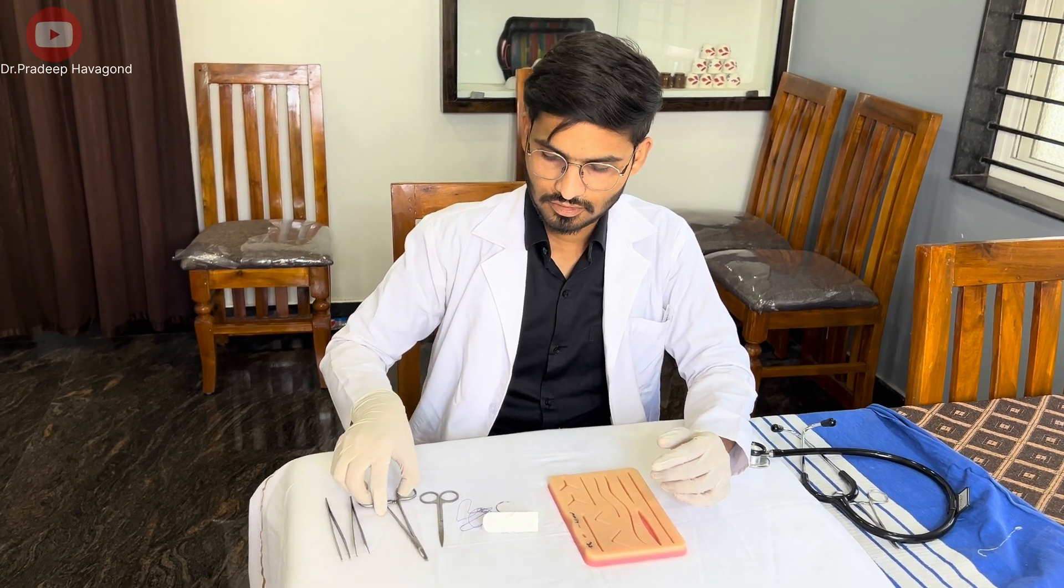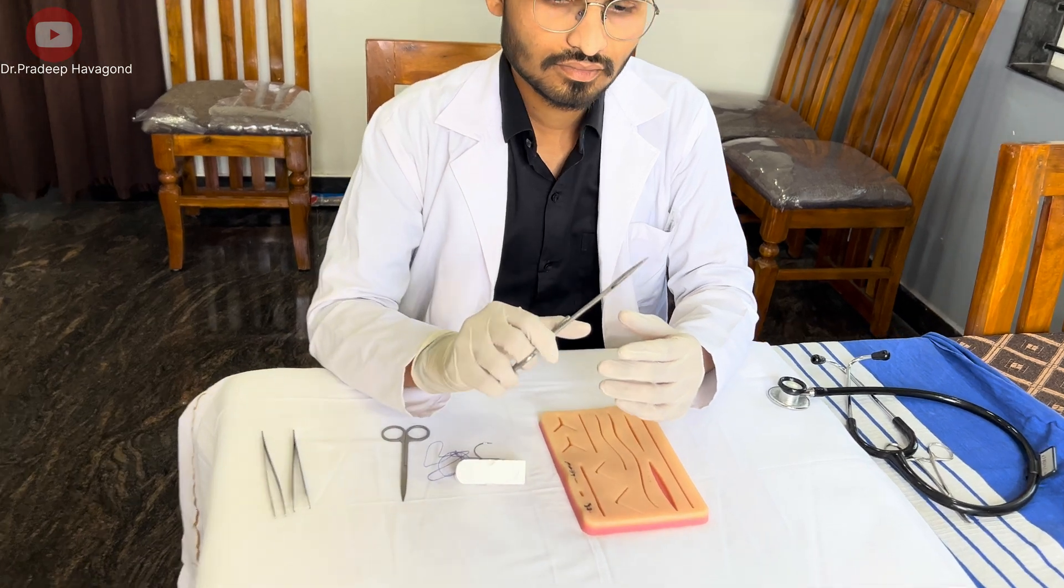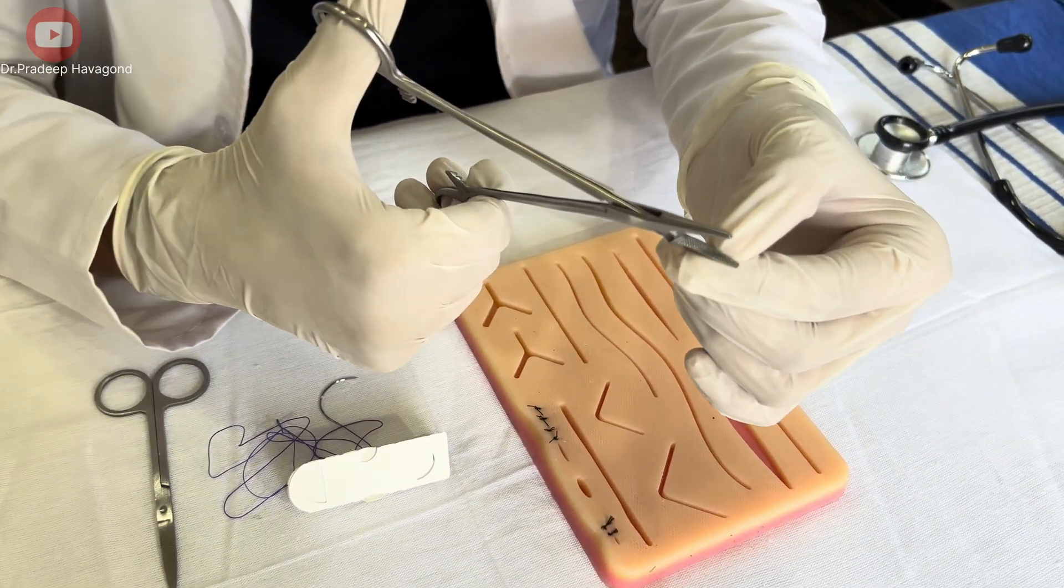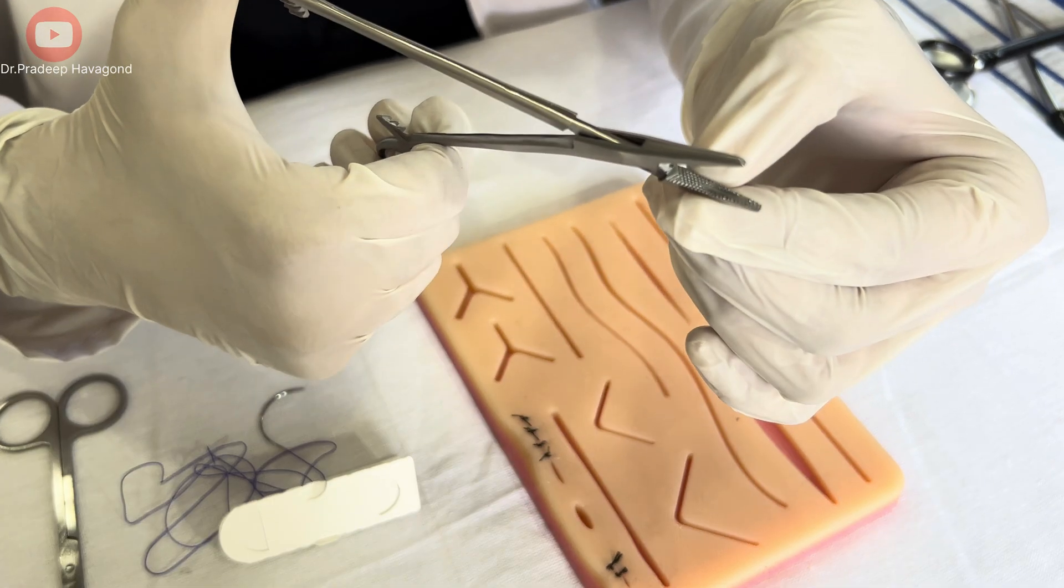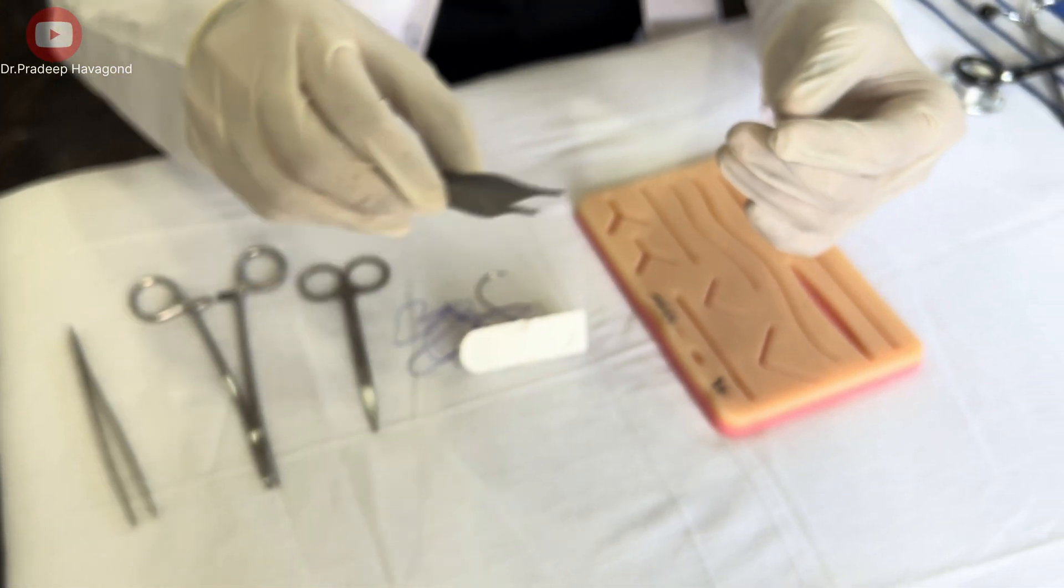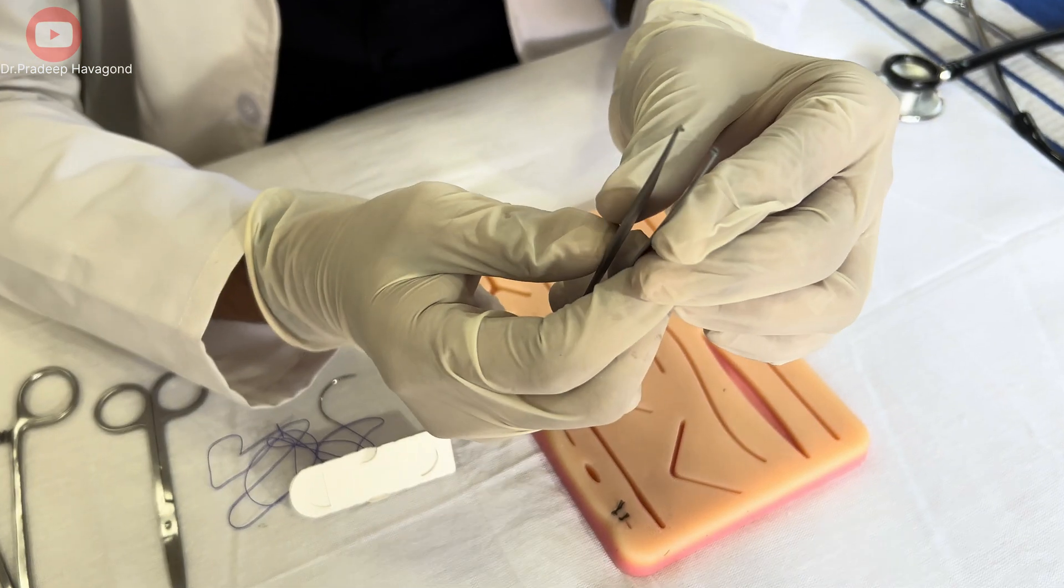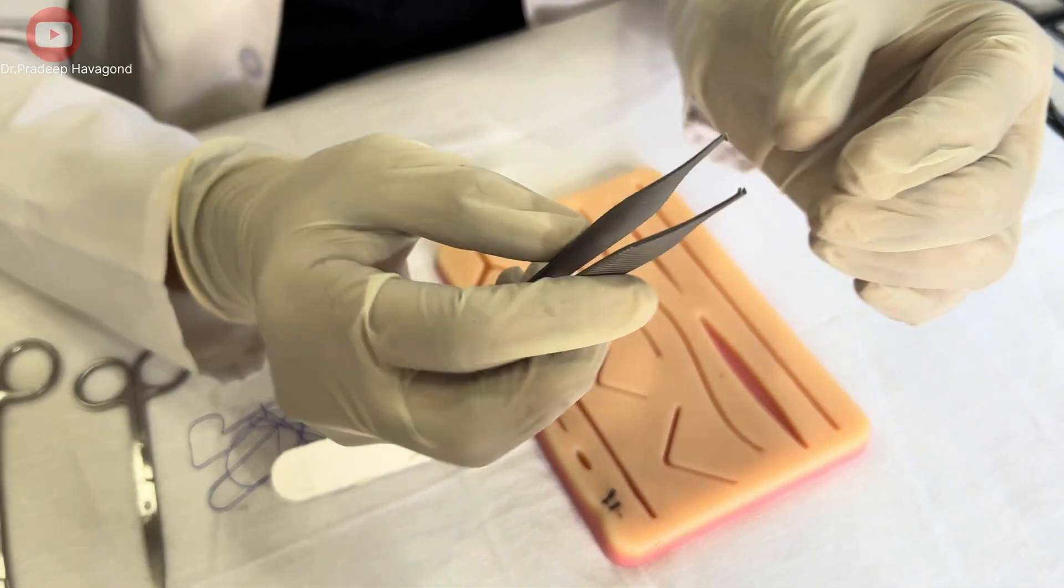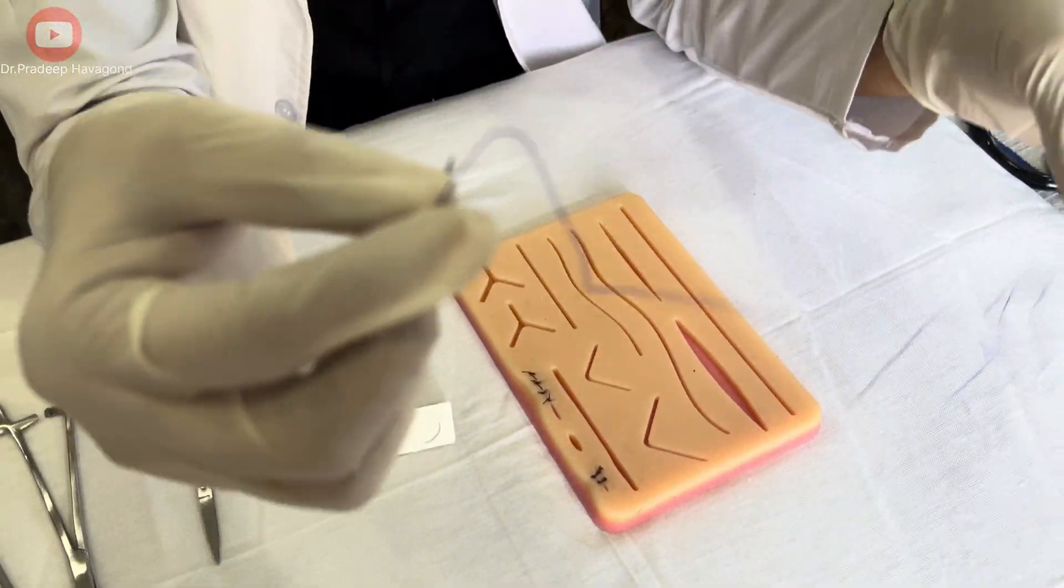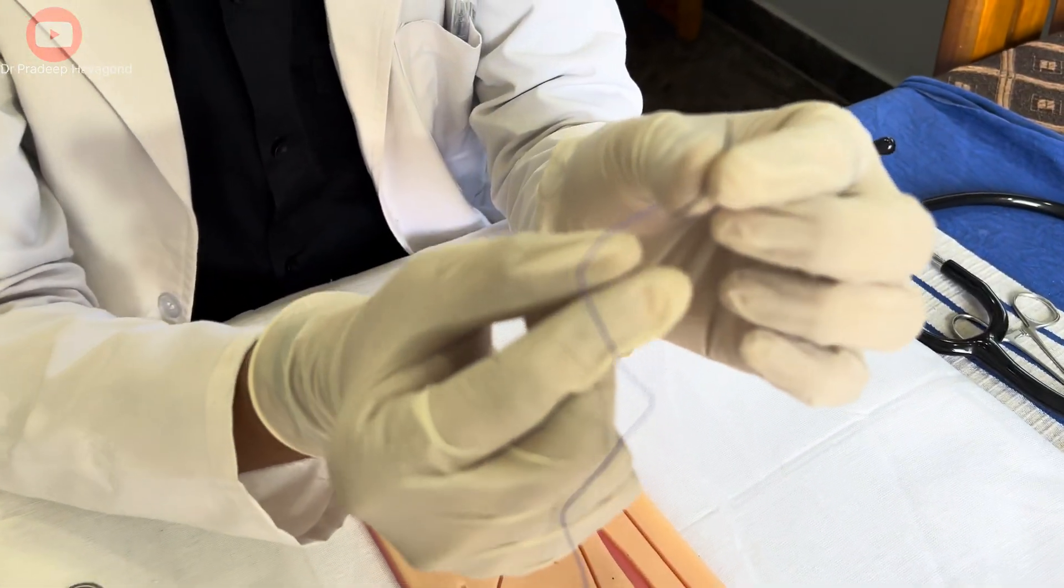Before we dive into the technique, let's quickly go over what you'll need: a suture kit with appropriate needle holder, toothed forcep, curved needle with suture thread, and plain scissors.